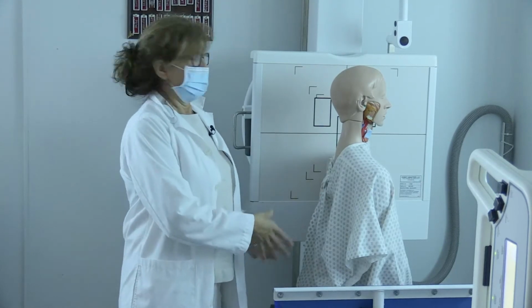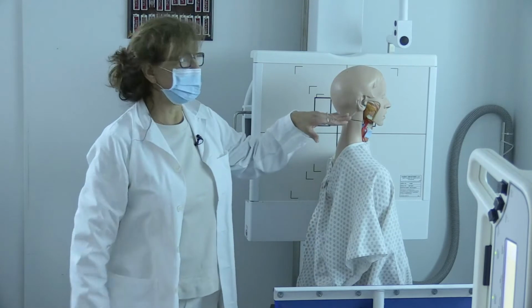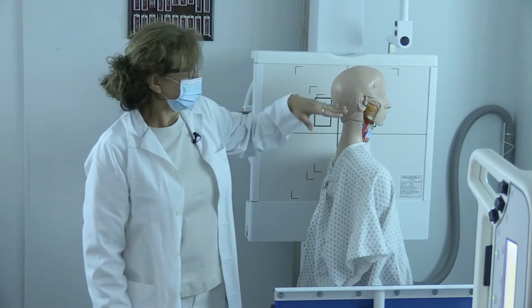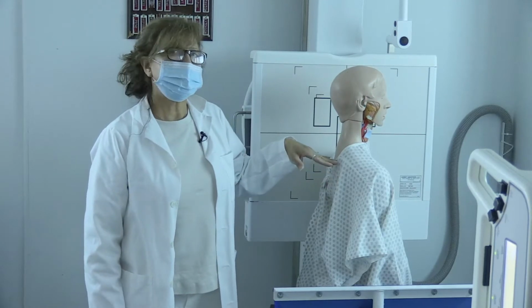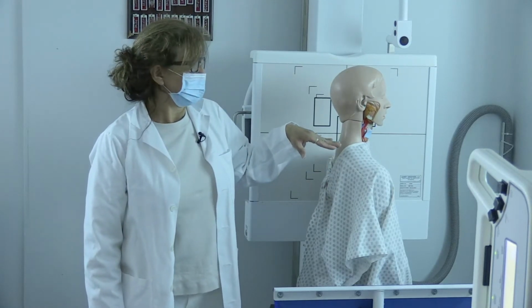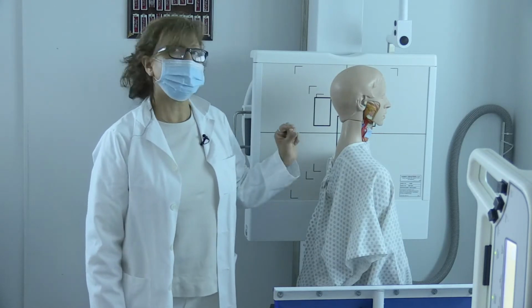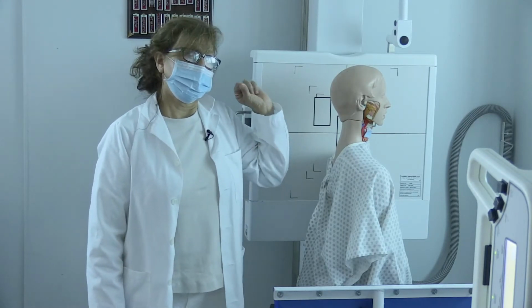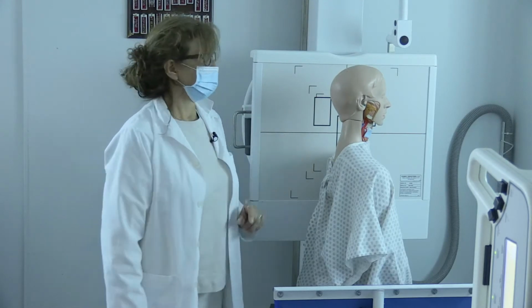That's lateral C spine. In this projection, you should see between C1 all the way to T1, and you want to see the interspaces of C7 and T1, that disc space, clearly. You also want to see the top third of T1 clearly.